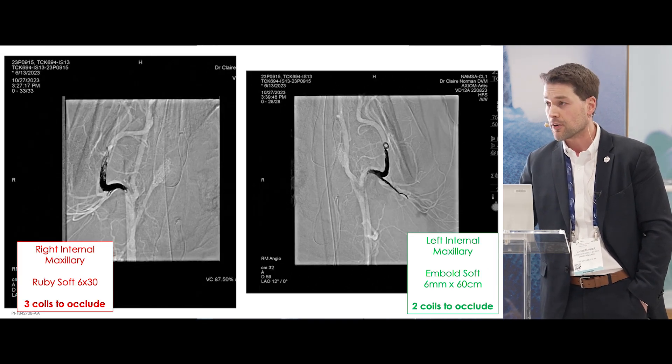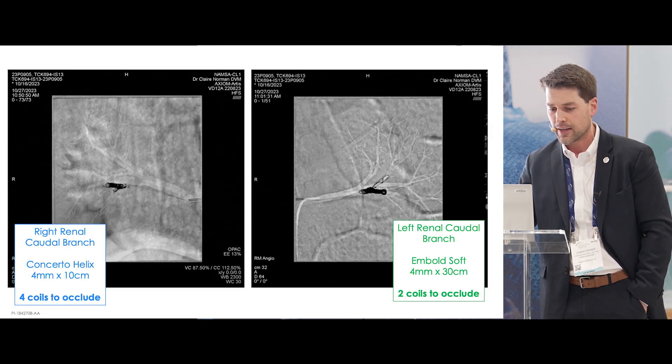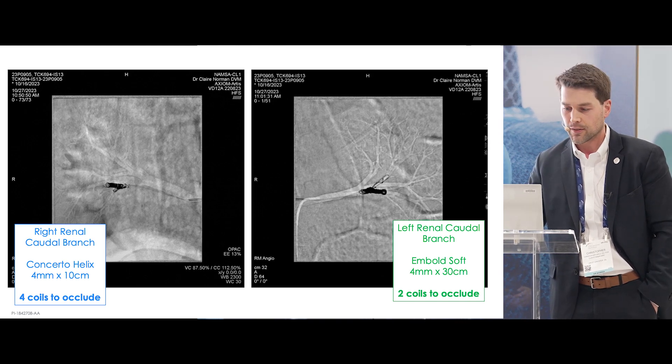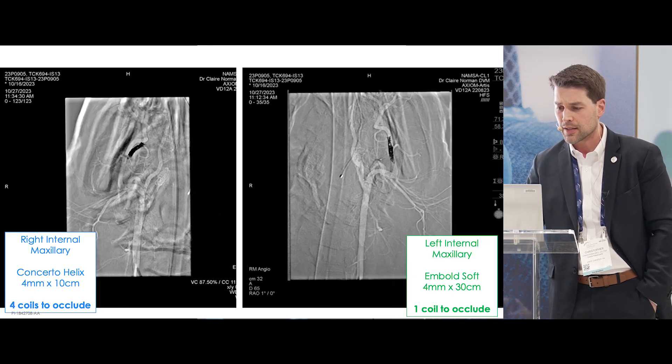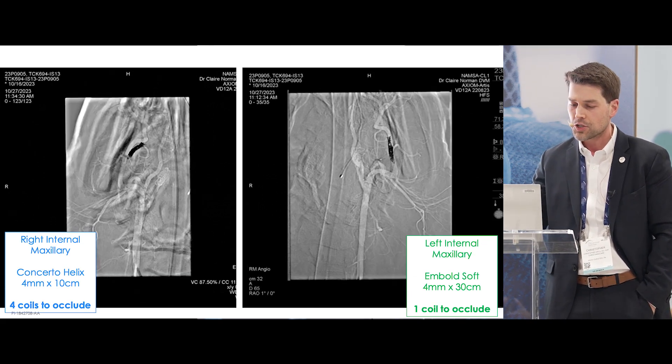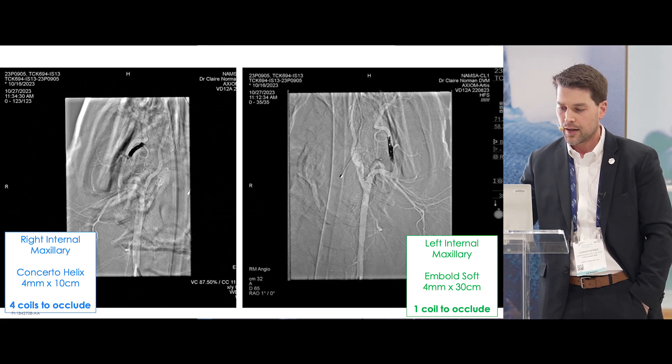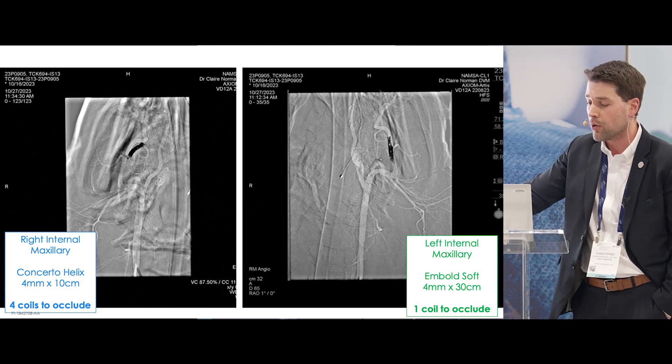Here's the same comparison in the internal maxillary artery. And then the comparison between the concerto and the embold soft in smaller vessels — as you can see, the coil packs look similar, about the same shape and density. But we have real data on that. In the right and left internal maxillary: four concertos versus one embold.